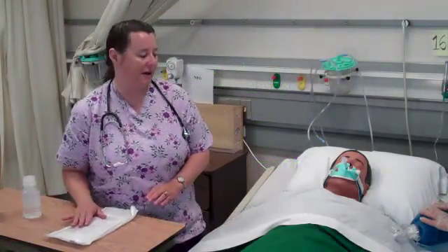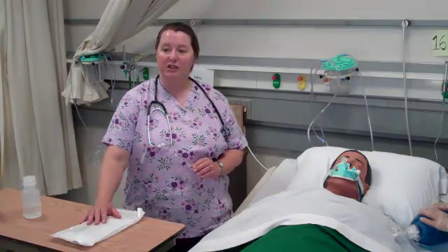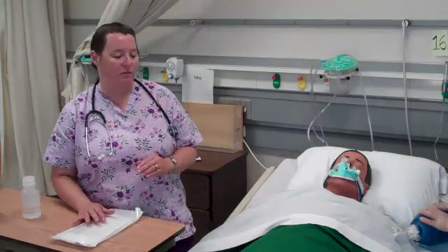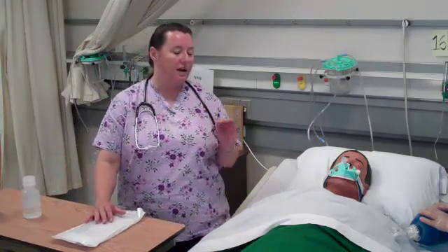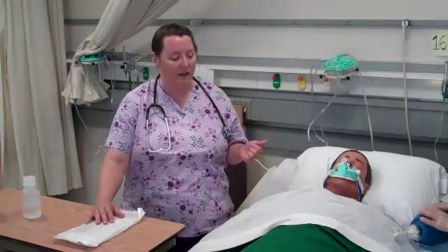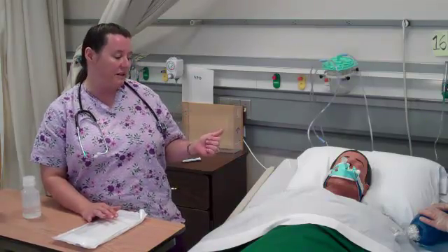We're going to be doing a demonstration on endotracheal suctioning. This is an invasive procedure, and we need to make sure that we have a doctor's order. Most times an endotracheal patient is in the ICU and you have standing orders available to you for intermittent suctioning if the patient's condition warrants it.